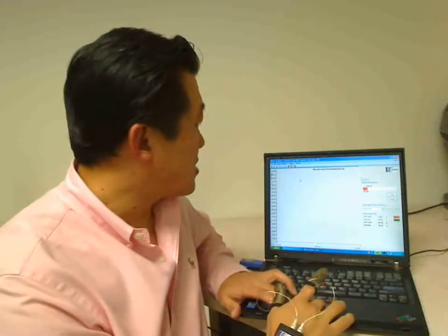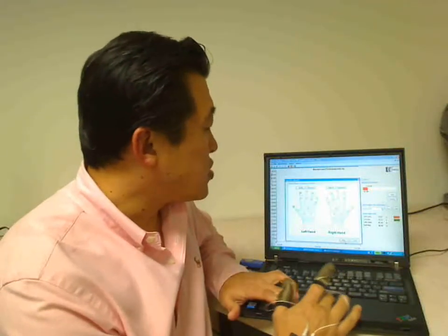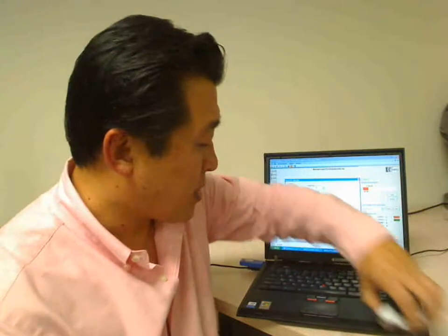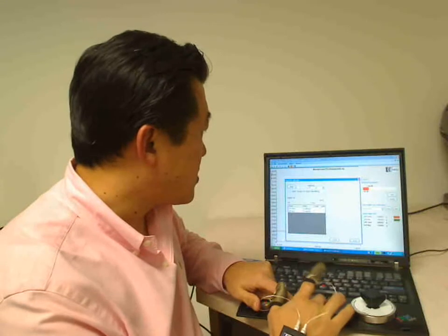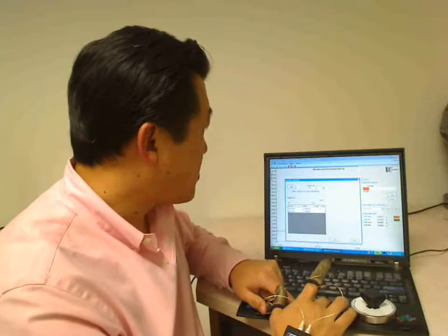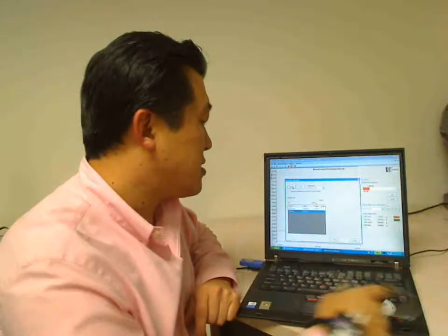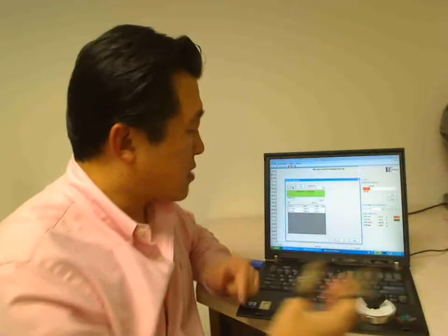First I'm going to do a calibration so that we can ensure the force we're measuring is correct. Here we have a load cell that provides accurate force information. I'm going to press on it up to 1500 grams — 1.5 kilograms. All I need to do is apply steady pressure until the bar turns green, and then do that for the other thumb. Calibration is complete.